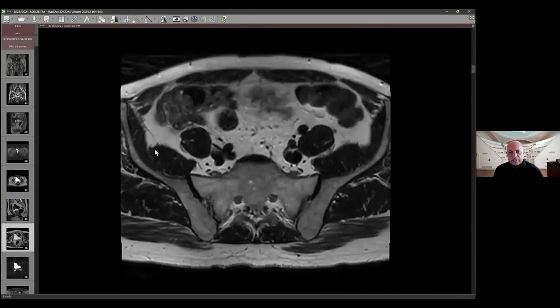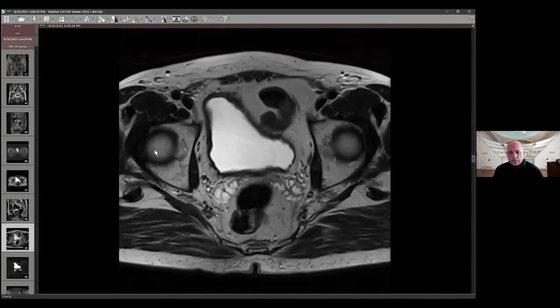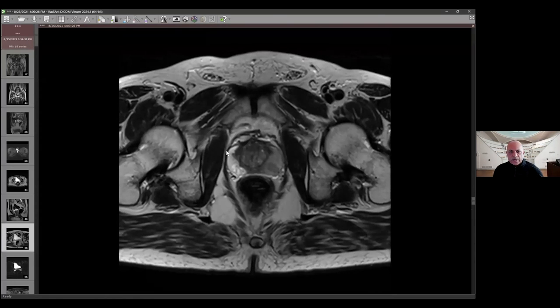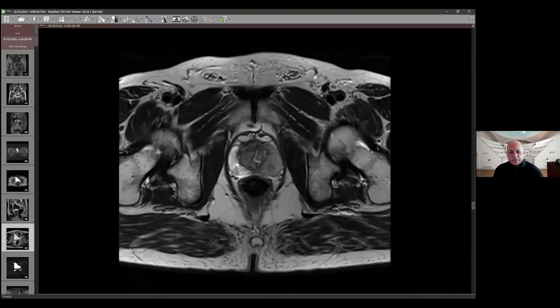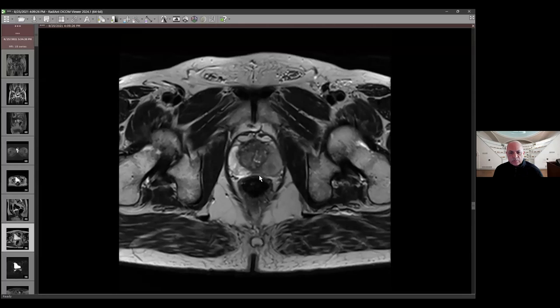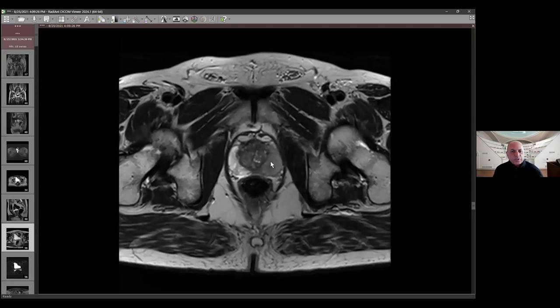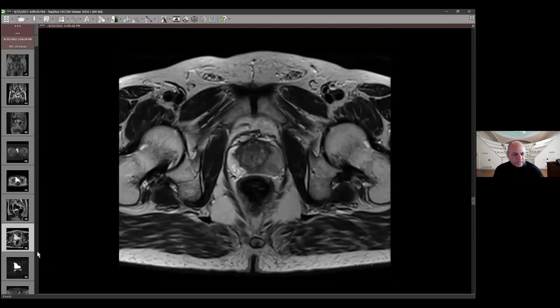Starting with the axial T2, you can see there is expected bright signal on the right side; the transition zone is not very large and has that bilateral symmetric appearance. In addition, what you're seeing here is that the entire left lobe of the peripheral zone is dark. And within that left lobe, there is an area that appears relatively more dark. So clearly something is going on there.